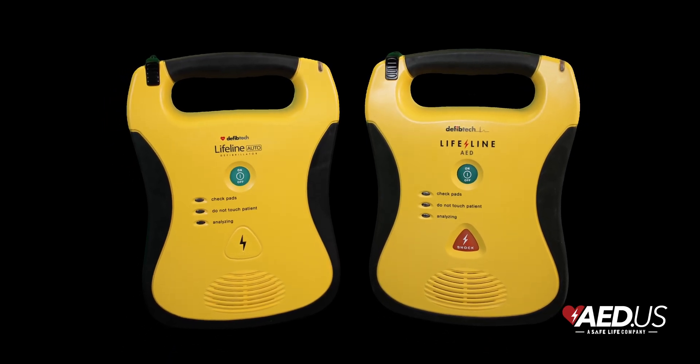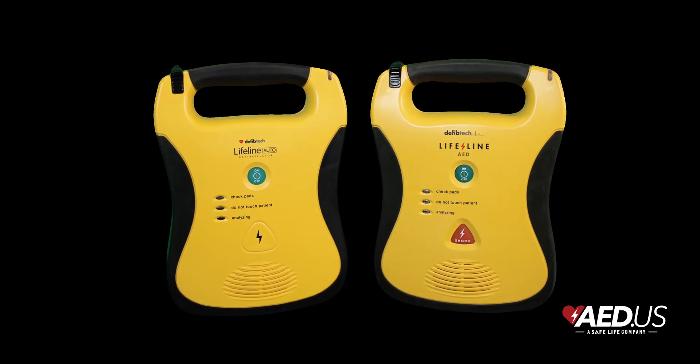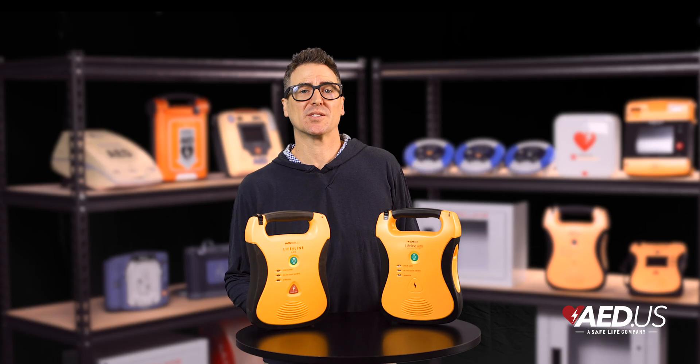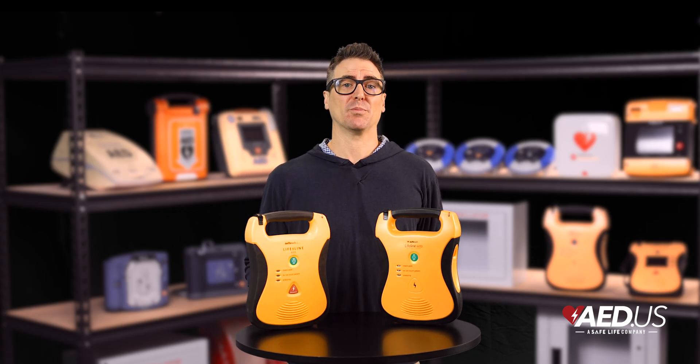When it comes to durability, the Lifeline AED is built to withstand rugged environments. It meets military standards for shock and vibration, and its tough outer casing, made from materials similar to football helmets, provides excellent protection.